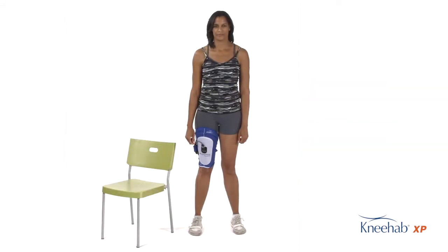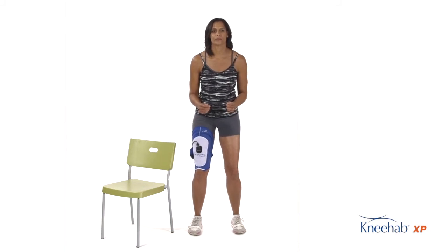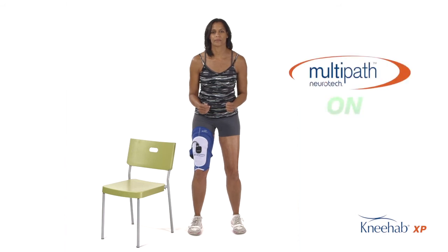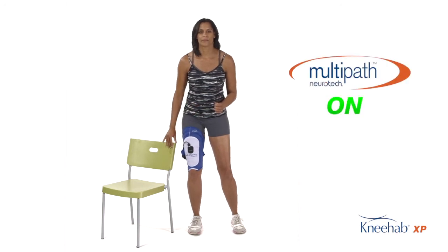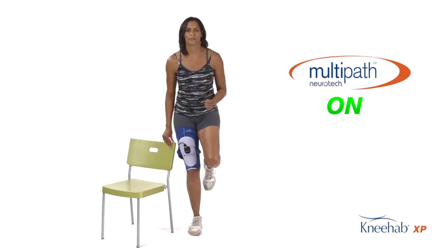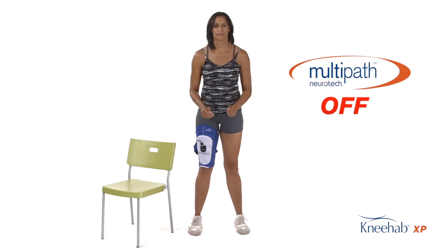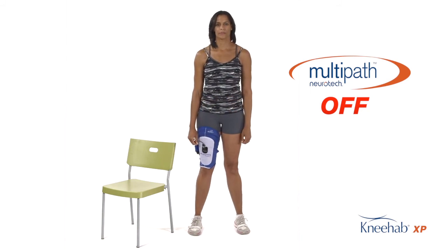For the level 4 exercise in stance, the patient sinks into a slight amount of knee flexion, as in a ready position or a slight crouch. The amount of knee bend should be comfortable for the patient. When the contraction of the device is felt to come on, the patient weight shifts over onto the leg with the Kneehab device and squeezes their quadricep, maintaining that slight bend at the knee. When the contraction releases, the patient places the opposite foot down and returns to even weight bearing. The knees may be extended briefly before the next contraction cycle begins.